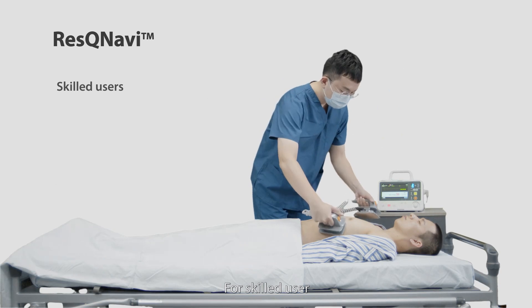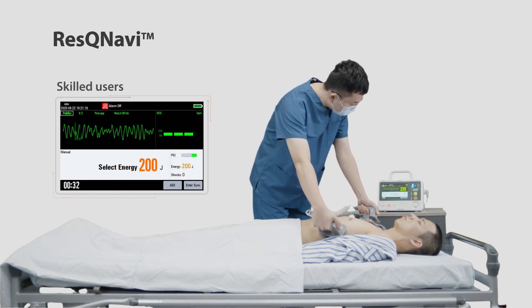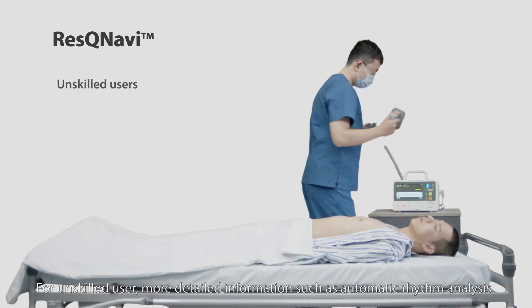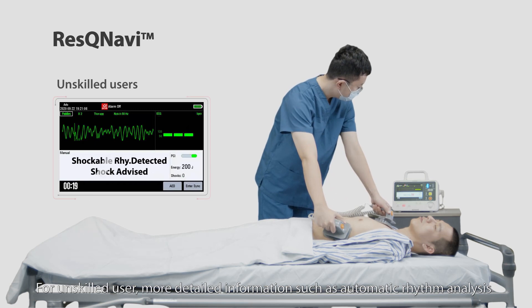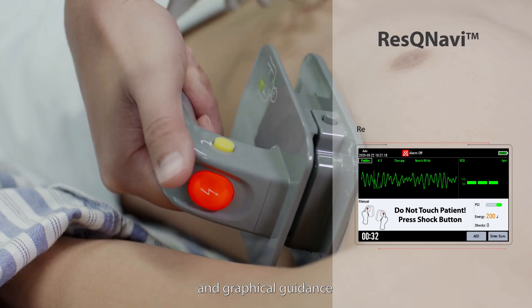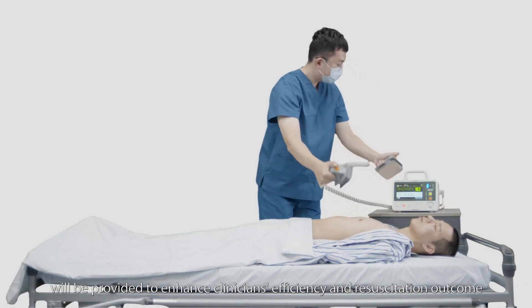For skilled users, there will be no typical guidance, but a regular operating UI. For unskilled users, more detailed information such as automatic rhythm analysis and graphical guidance will be provided to enhance clinician's efficiency and resuscitation outcome.